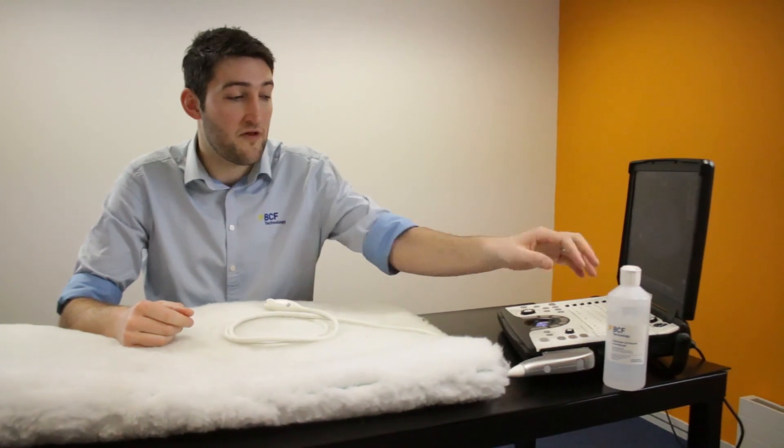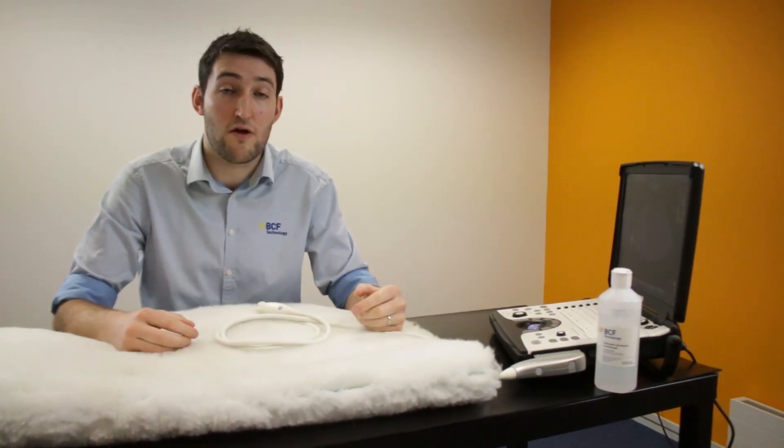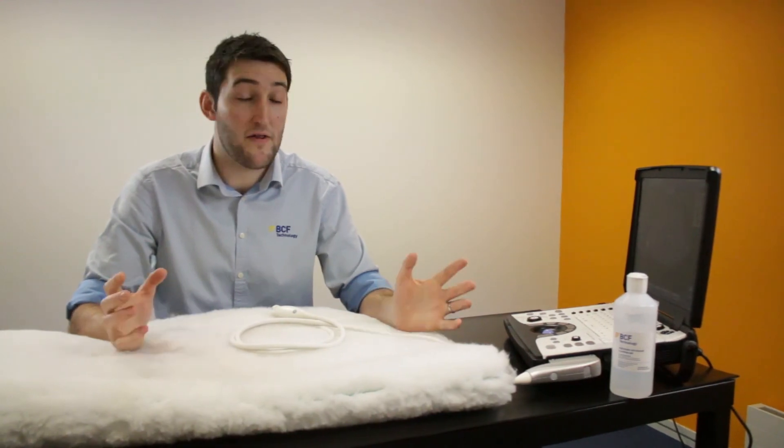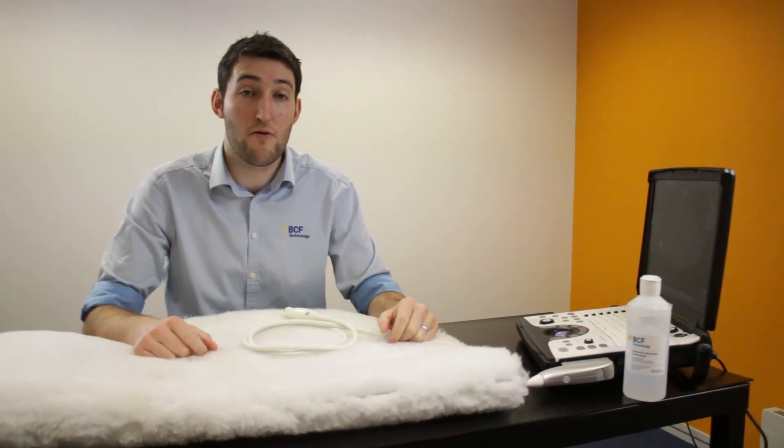You'll want some ultrasound gel and also some surgical spirit or alcohol. You can use that quite a lot to wet the hair. Other than that, nothing more is required.